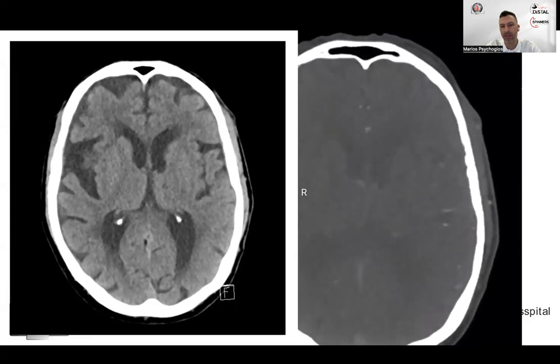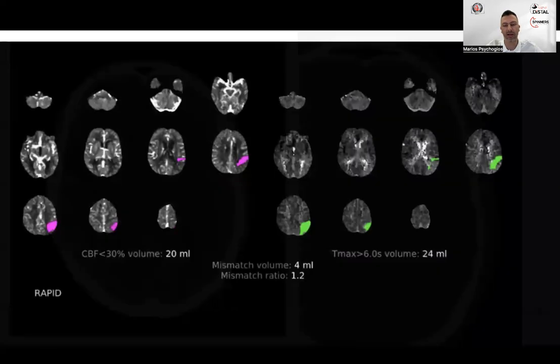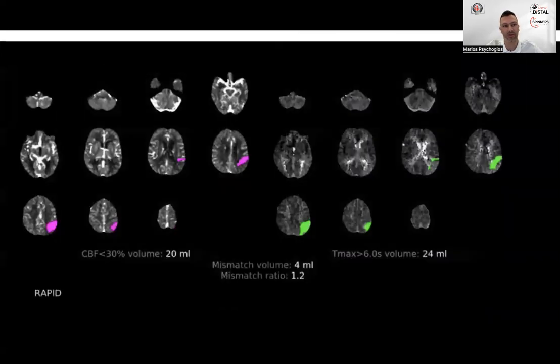But I sometimes find it difficult in these cases to actually find the occlusion on the CTA. This has also been shown on studies. And what really helps is perfusion on this. So we call perfusion actually the MeVO detector now. If you need an automated software or not, that's a big discussion. We use it here in Basel.